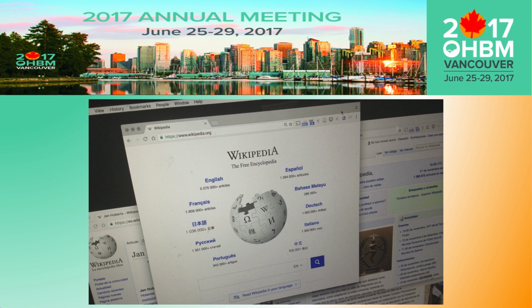We have, for the moment, worked on two first web applications. It's BrainBox, a web application that allows for visualization, editing, and curation of neuroimaging data on the web, and MetaSearch, a web application that allows for searching and querying the metadata of these available brain images. So in the end, you can have features such as age, sex, if there are disorders or diagnoses for the people, you can search according to your needs and create your own projects.